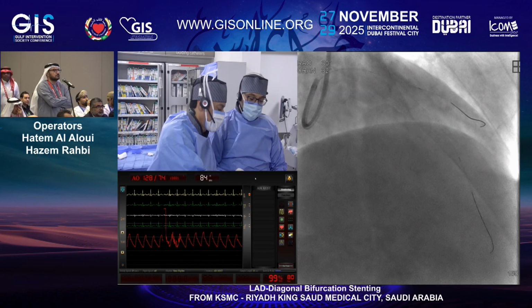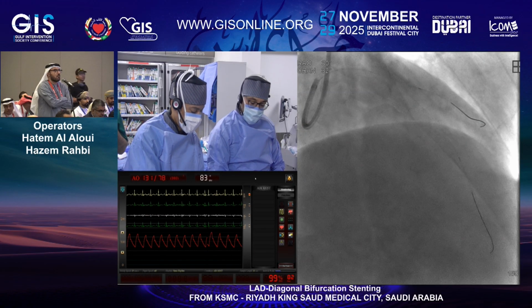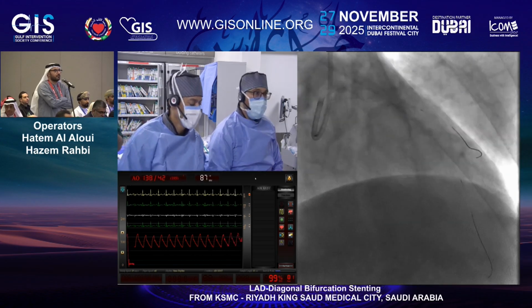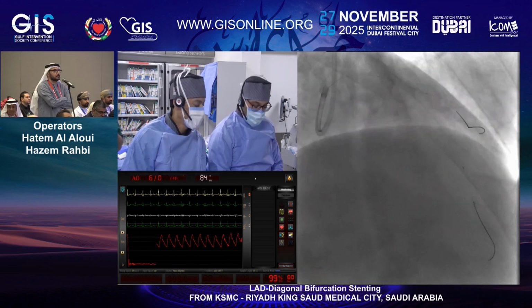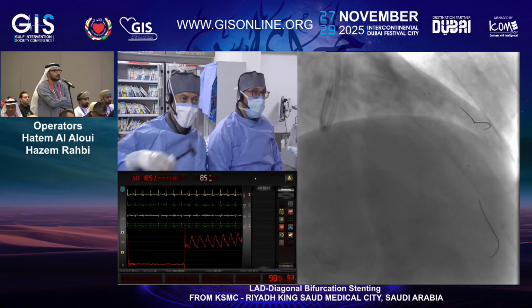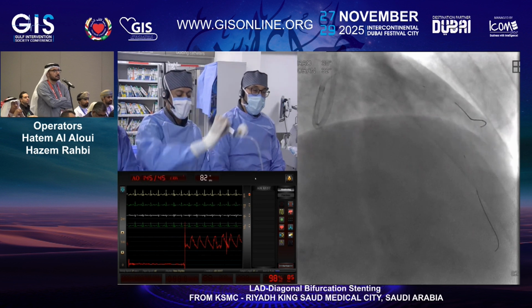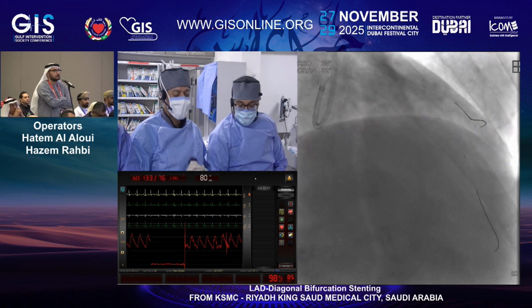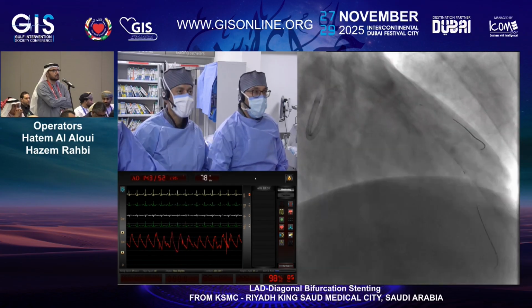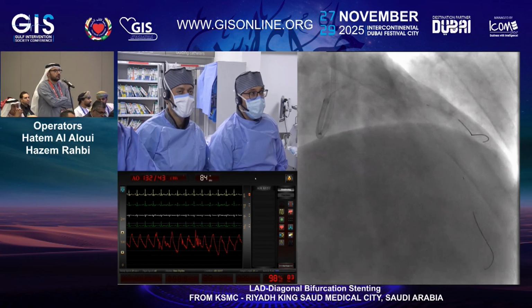Yeah, you have seen we tried to prepare the lesion very well, Dr. Abdullah. So we went with an NC and we went with the 3.5 cutting balloon, and the residual lesion, actually, I don't like it too much. We have more than 50% residual lesion. If the result was good after lesion preparation, I would definitely not stent it. But I'm not happy with the residual lesion.